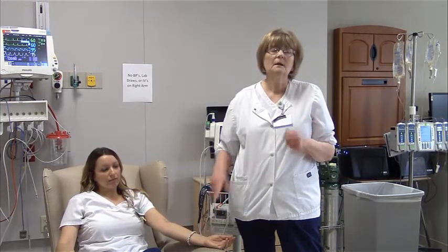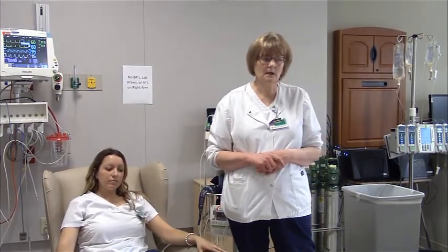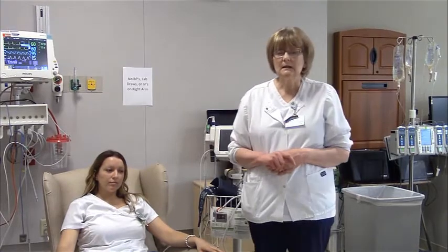Okay, stop. Take that number, multiply it by 2, and that is your heart rate. That's the easiest one to get.